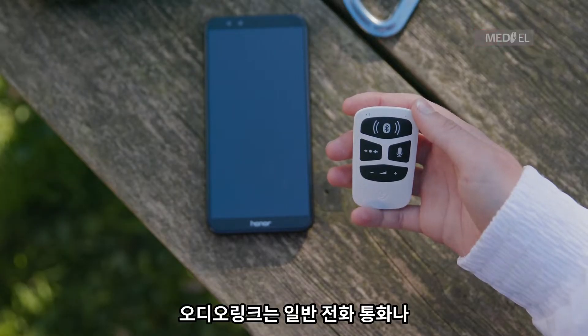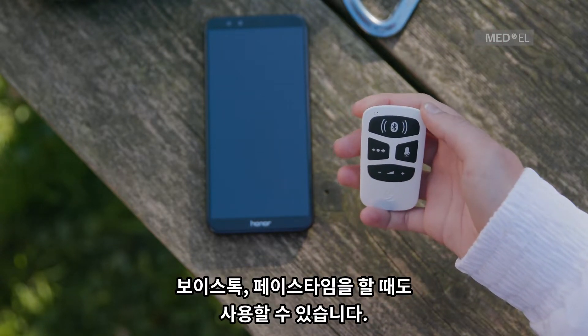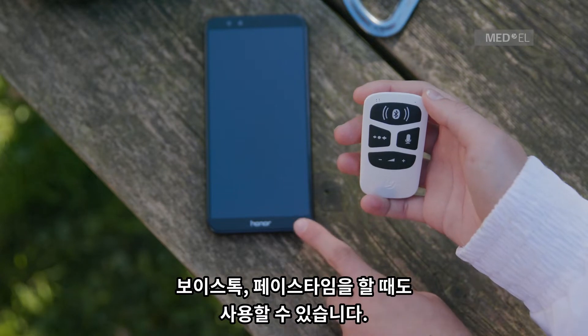AudioLink can be used for conventional phone calls and also for voice over IP services, such as Skype or FaceTime.